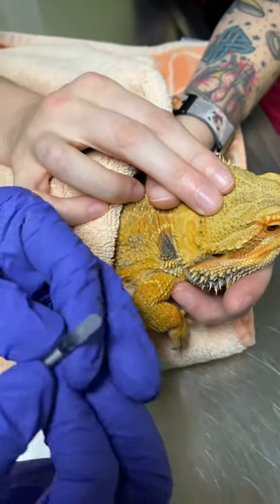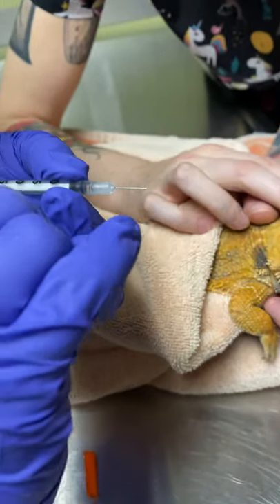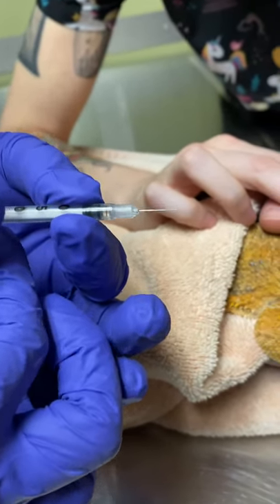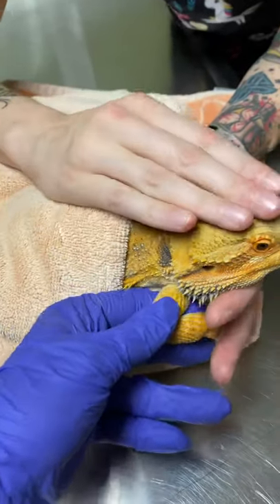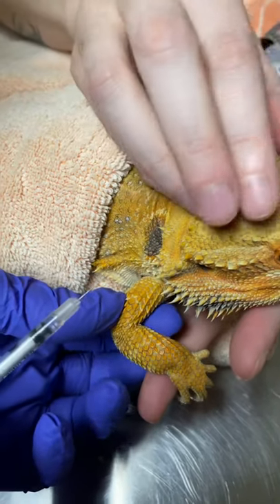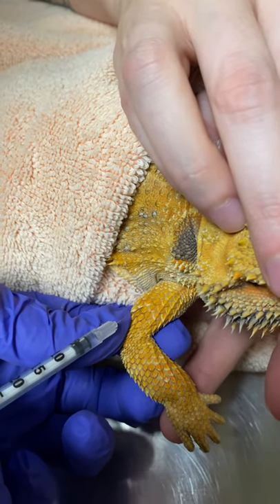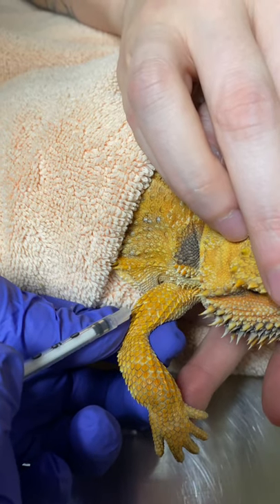I have no air in the syringe. Bevel side up — which means the slanted part is facing up. When I'm going to inject it, I'm not going to go slow, I'm going to go at a normal pace. I'm going to pull back and make sure there's no blood, and then I'm going to give the injection. Directly in, pull back, no blood, push.